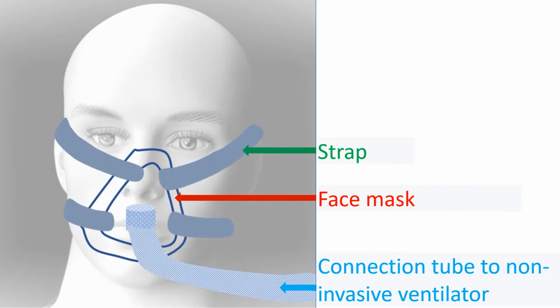Non-invasive ventilator is usually a smaller device with less sophistication. It is connected using an external mask which is tight-fitting over the nostrils and mouth. A good air seal at the mask-face interface is needed for proper functioning of non-invasive ventilator. Too tight a mask can cause skin injury and discomfort to the person.